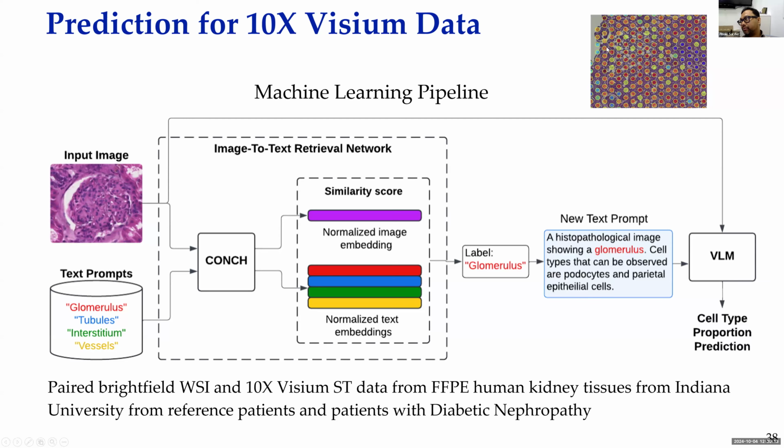As you know, it uses spots that are a little far apart, and they provide like 20,000 transcripts of information, which can tell us not exactly the cell type at single cell level, but at population level. And this student went a little far, and he tried to show, based on this work, how good engineering principles and intuition can be applied.